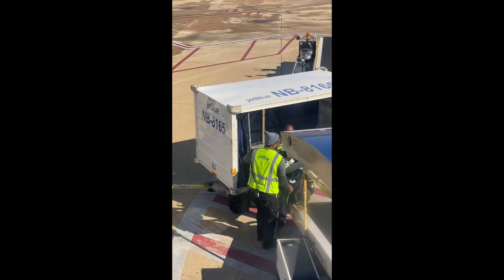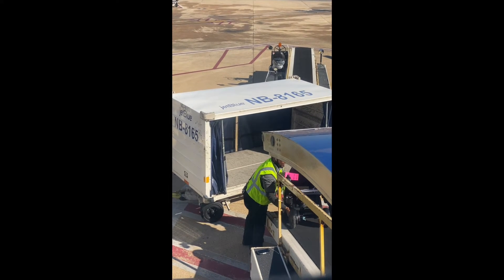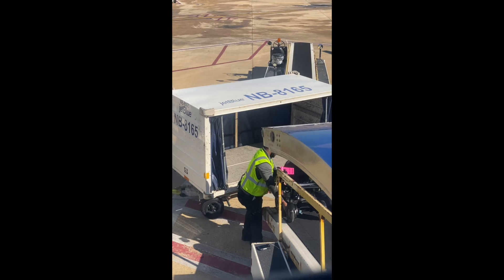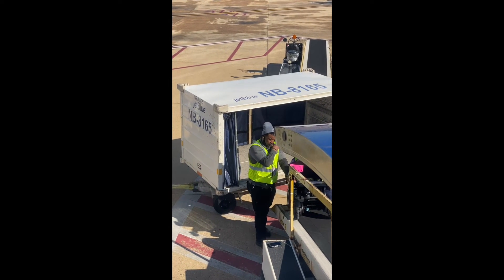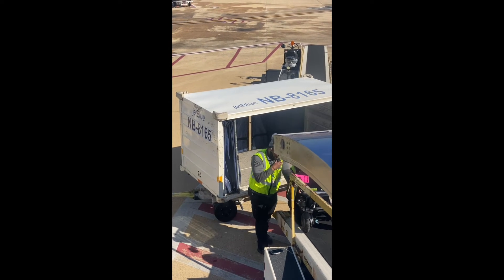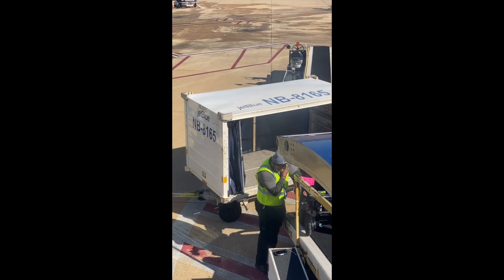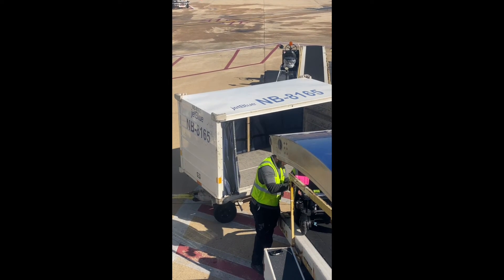We taped both forms to the chair on the front and the back so that it is easy for the ground crew to review and impossible for them to miss. As you can see, the chair started to roll down the conveyor belt. This happened because when you turn over your chair you need to put it in freewheel mode. After a little bit of discussion, one of them hops onto the belt to hold the chair and push it up into the plane.